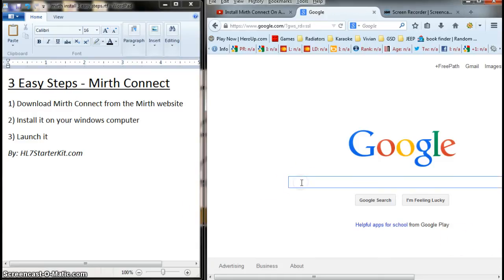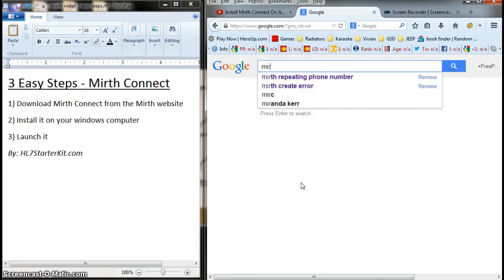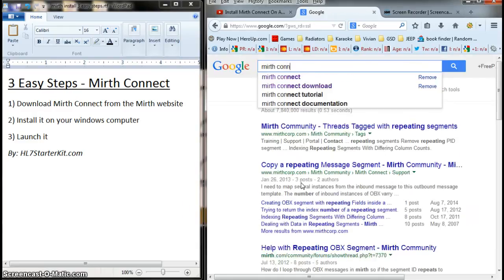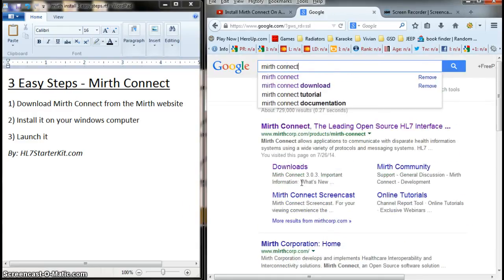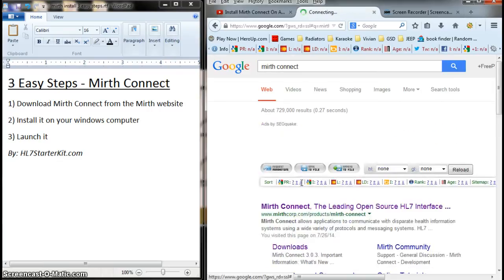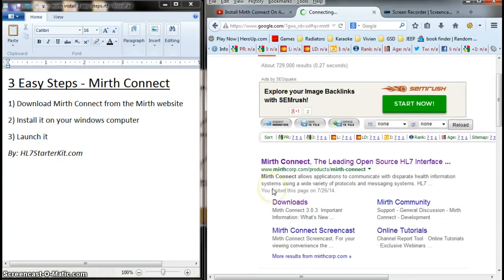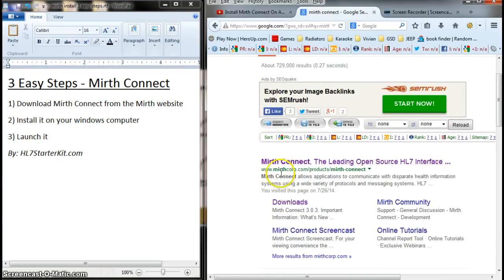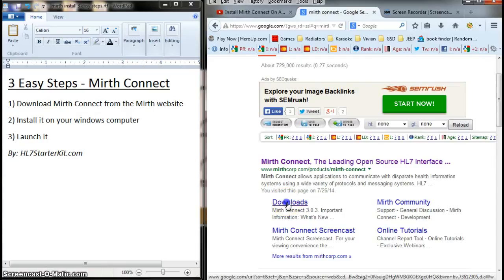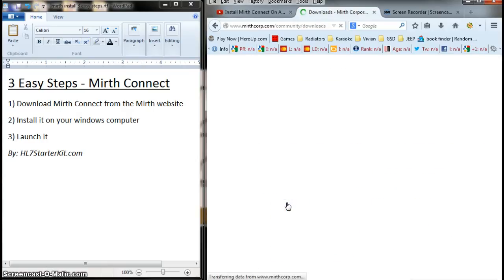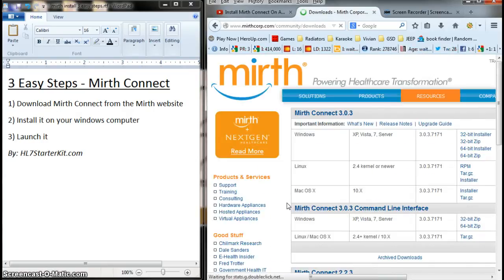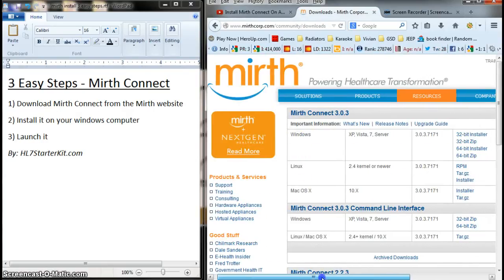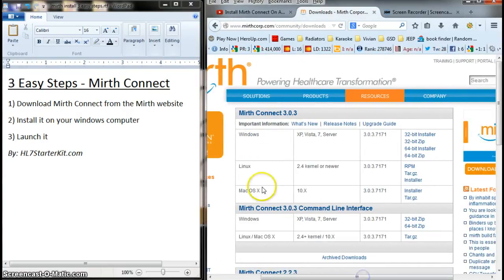Just go to Google, we'll do this live, and type Mirth Connect. Google will display Mirth Connect website at the very top. You just click the Downloads link. I don't mean to rush, but I just want to make sure we can get through this pretty quickly.